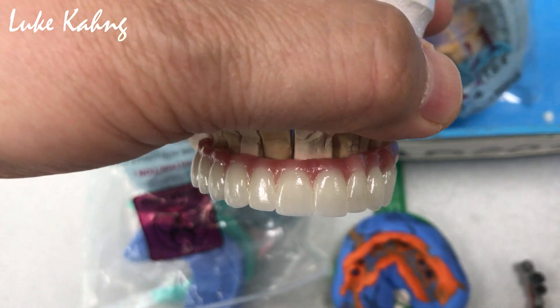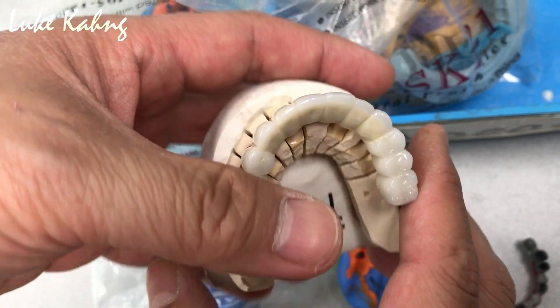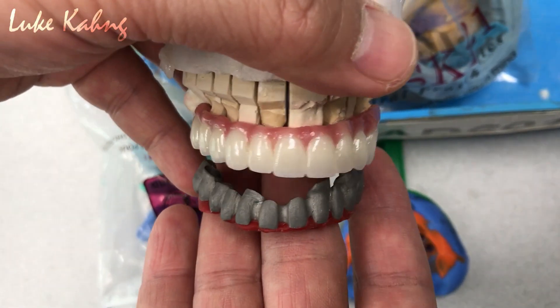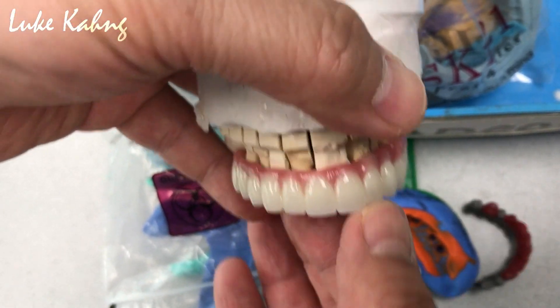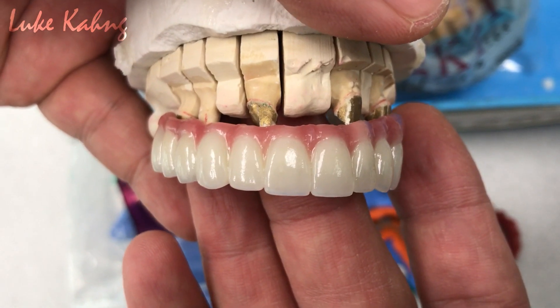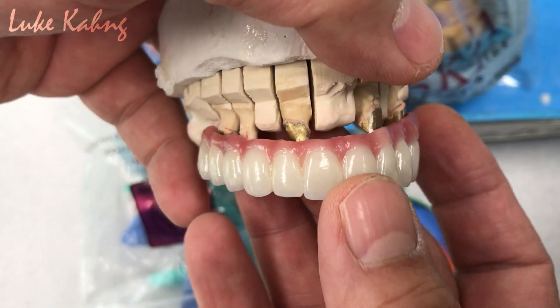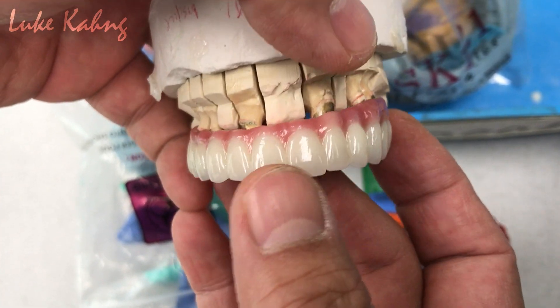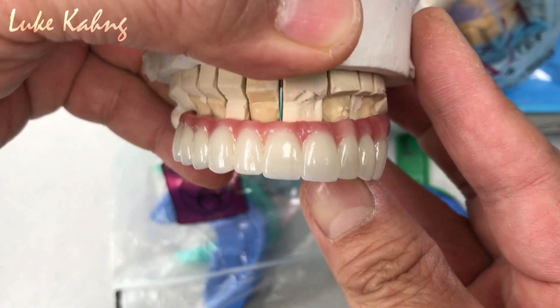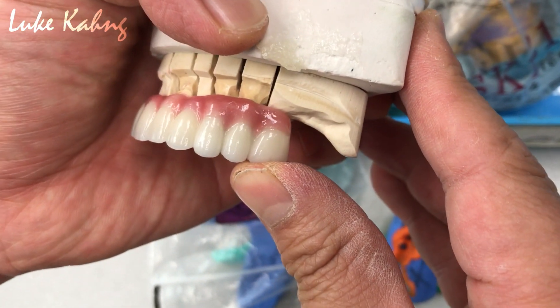Six-unit implant with porcelain fused metal case. Here is the framework — check the bite. This is the finalized version. After the try-in, the doctor took the pickup impression, and then we created the gum as much as possible. This is the final work — now we can send it out to Michigan.